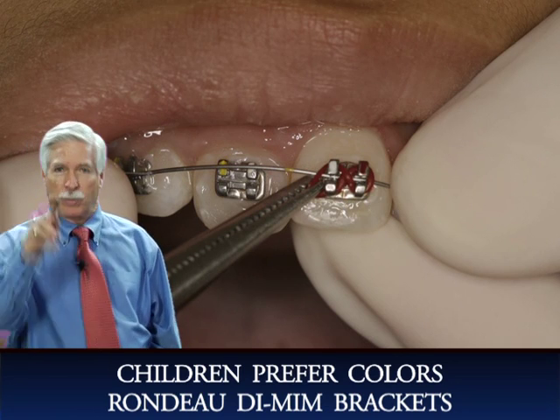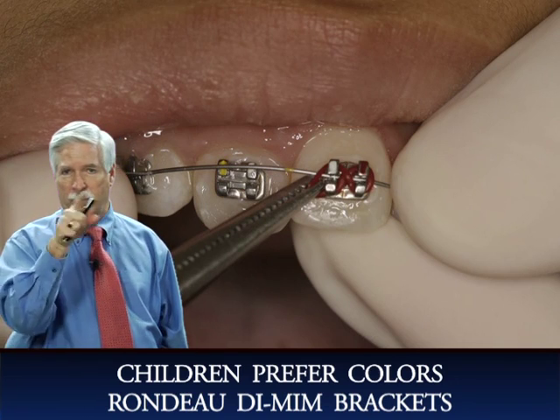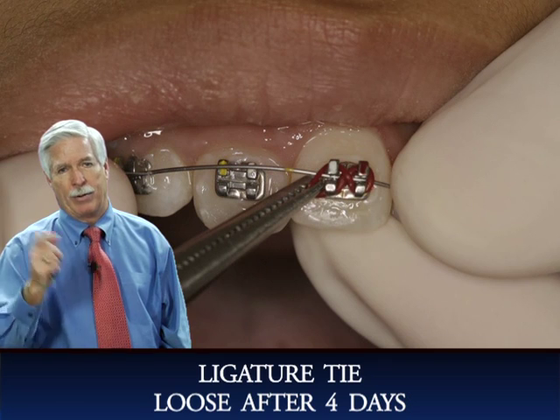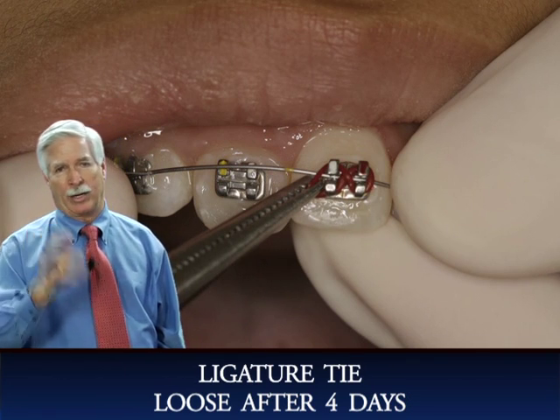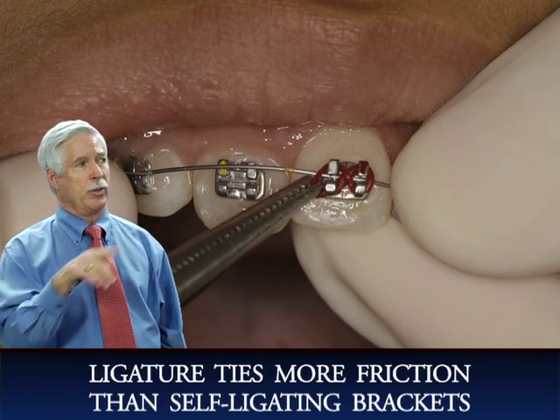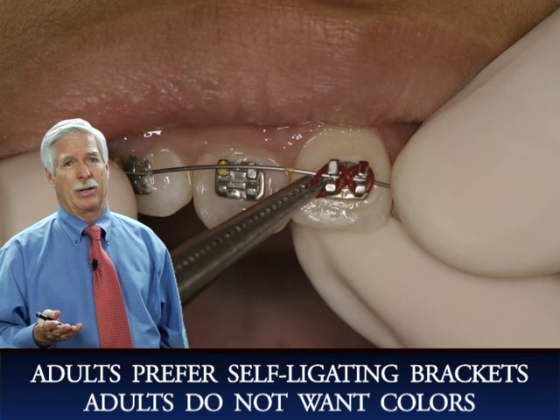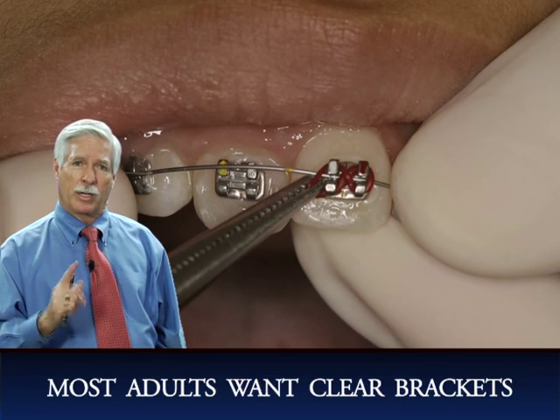The other thing you've got to realize, when you figure 8 that elastic donut around the brackets, after 3 or 4 days, it loses almost all of its strength, and it's like a piece of spaghetti when it comes out. So it holds on initially quite firmly, but after a while it loses strength, and I don't think it slows it down that much, although it definitely slows it down more. There's more friction with this than there is with the self-ligating brackets, no question. Self-ligating brackets I would use on adults because adults don't want the colors. But I'm finding that most adults want the clear brackets.